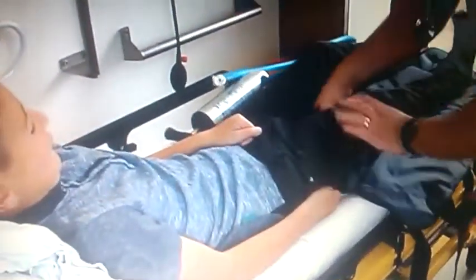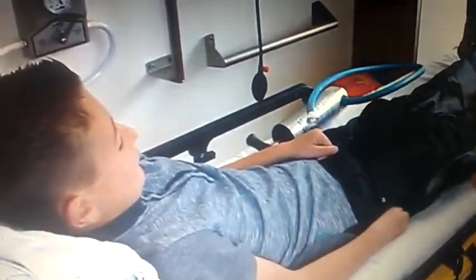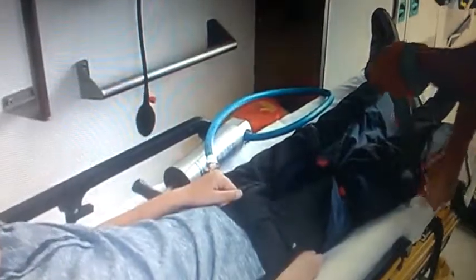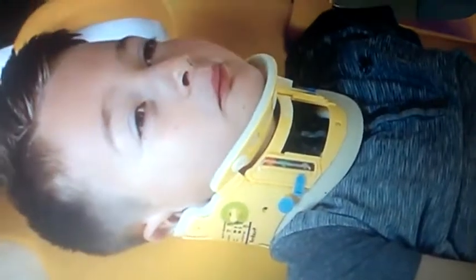What do you keep in the cupboards? We have some splints, and the reason we use these splints is if you break your leg or your arm, we can put this vacuum splint around your leg, take the air out of the vacuum splint, and it keeps your leg in a nice stable position. And then if that leg's in a stable position, then the bones are still, hence you don't get any pain. We also have a collar. If you fall off your bike or you're hit by a car or anything like that, we want to keep your neck and your back in alignment. So what we do is we place you on a board, which we have like scoop boards, but we put a collar on to stop you moving your head left and right.